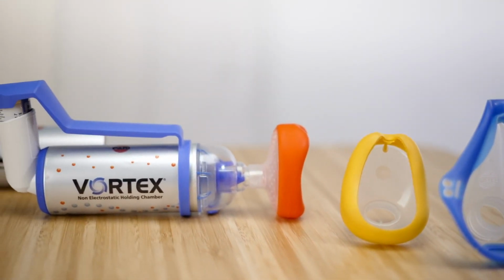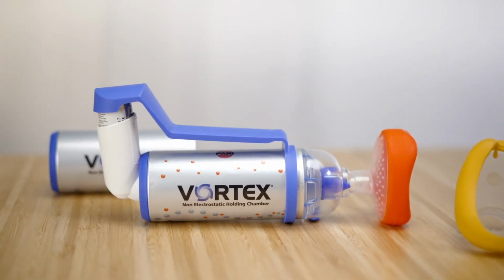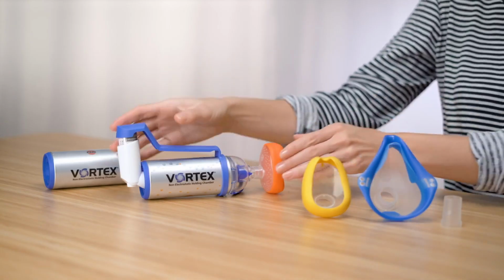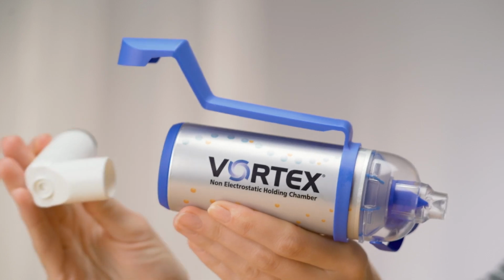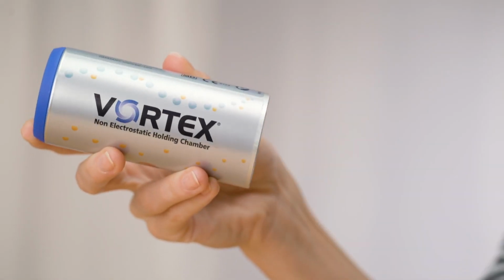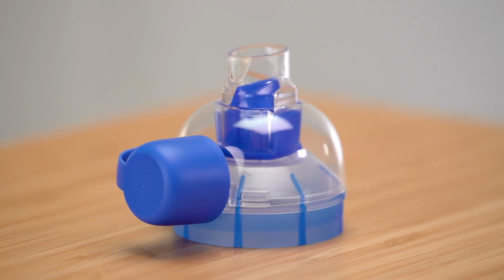Cleaning is an easy 3-step process: preparation, cleaning, and drying. Wash your hands thoroughly before each cleaning session. Detach the mask from the mouthpiece. Remove the dose inhaler from the connecting ring. Disassemble the vortex into its individual parts. Make sure that the protective cap is open.